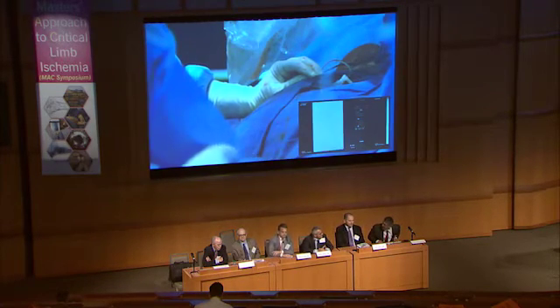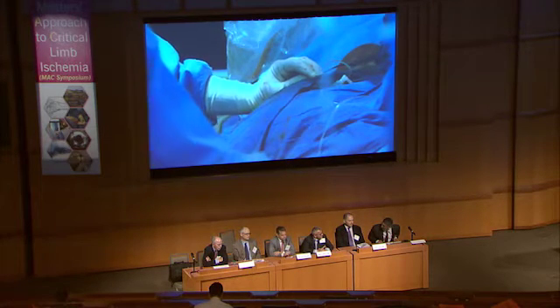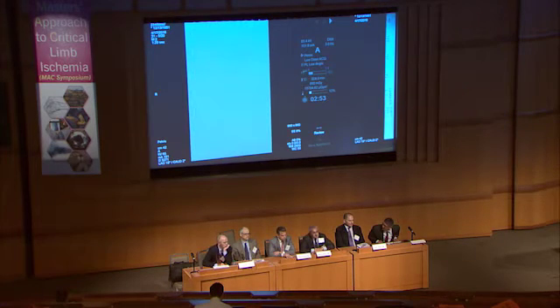Manzi and Alex. So the edge of the Viabahn is an area of potential concern in the future. DCB for another application of DCB, to put an expensive device at the edge of a more expensive device and see if that helps?